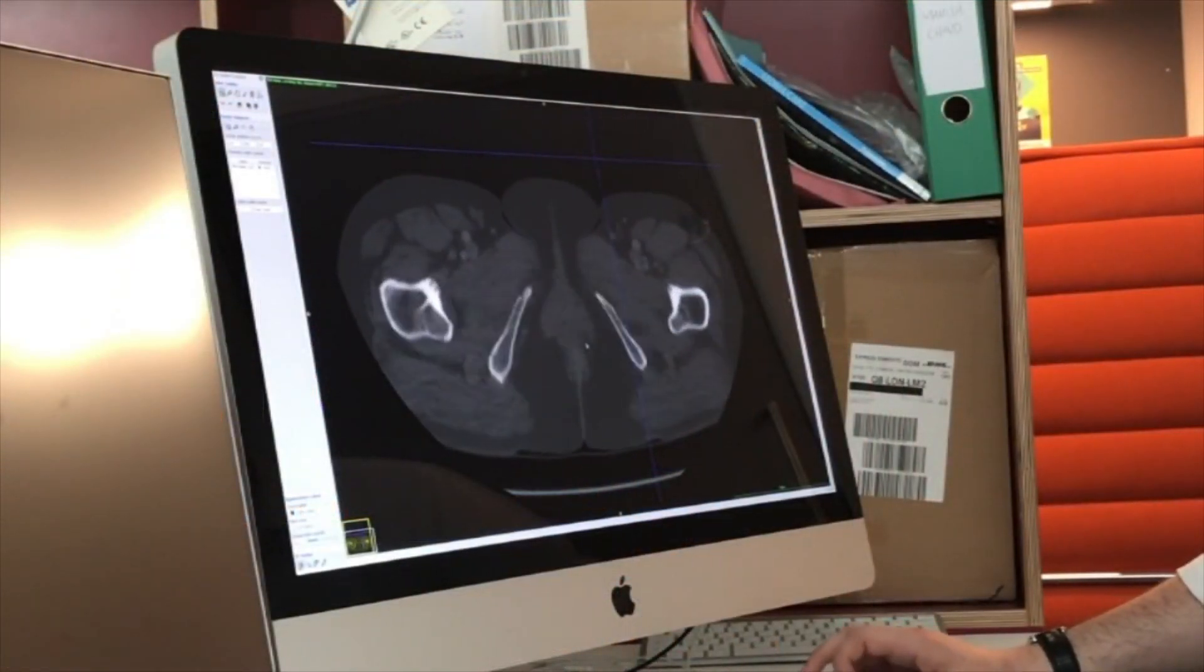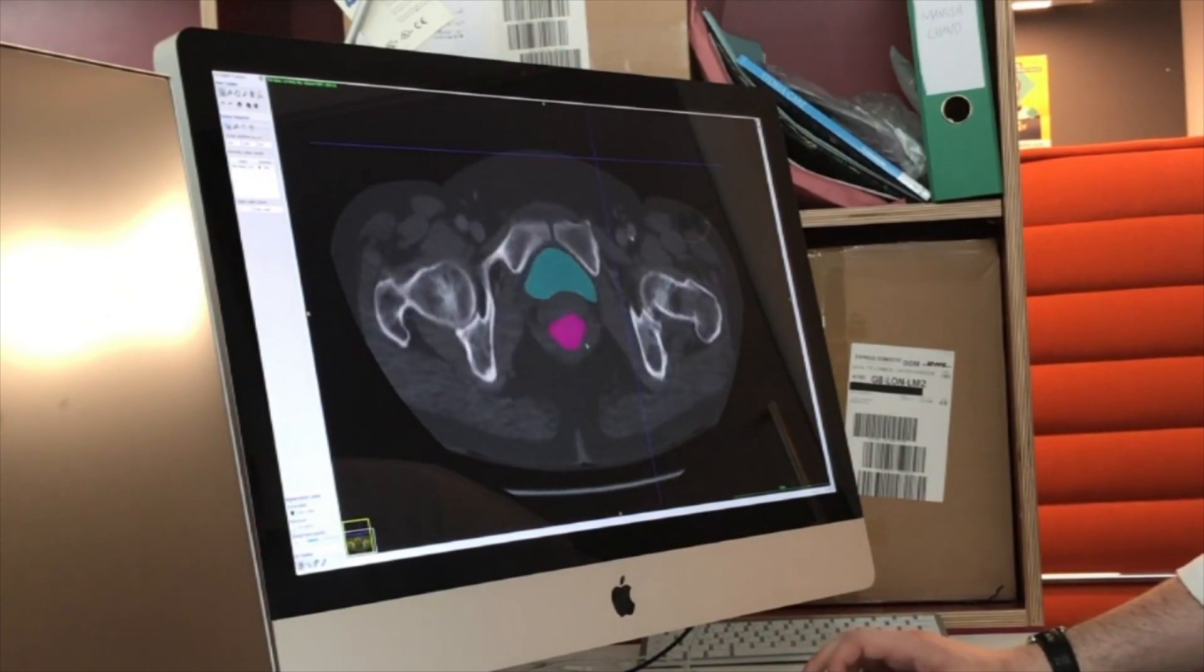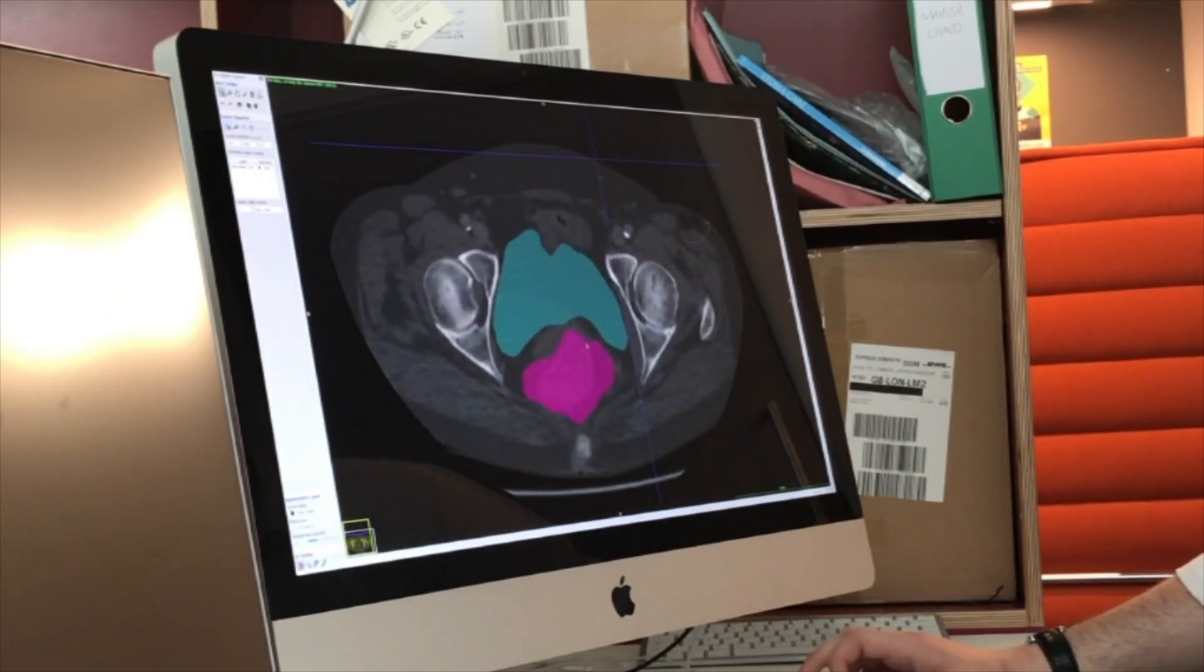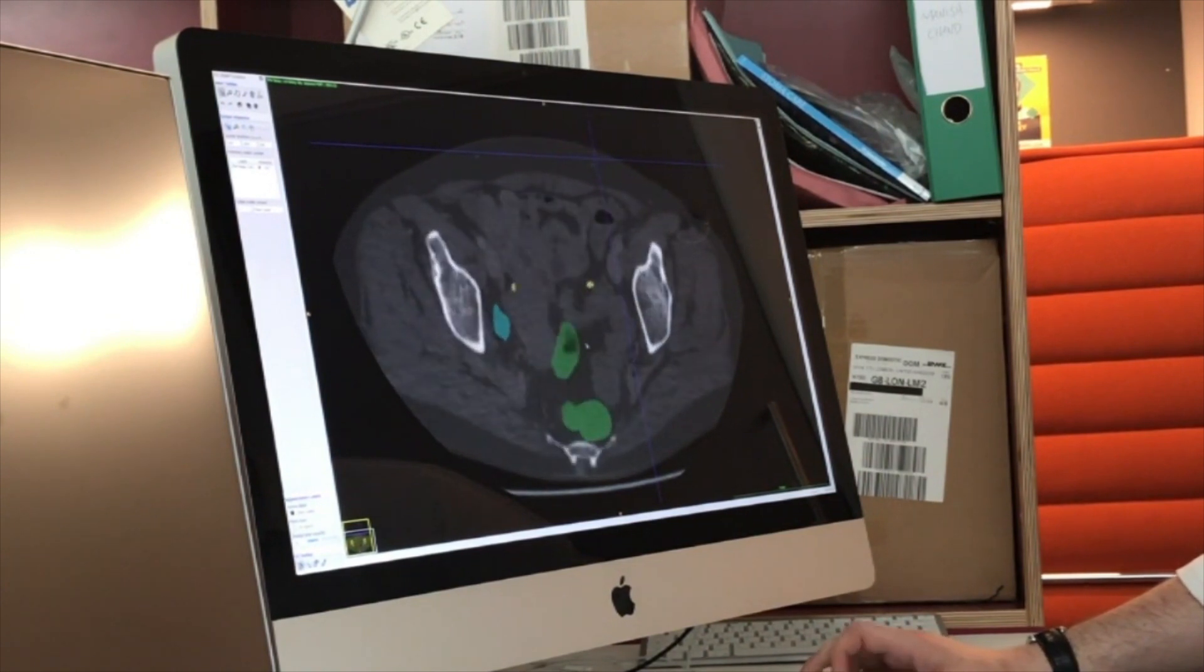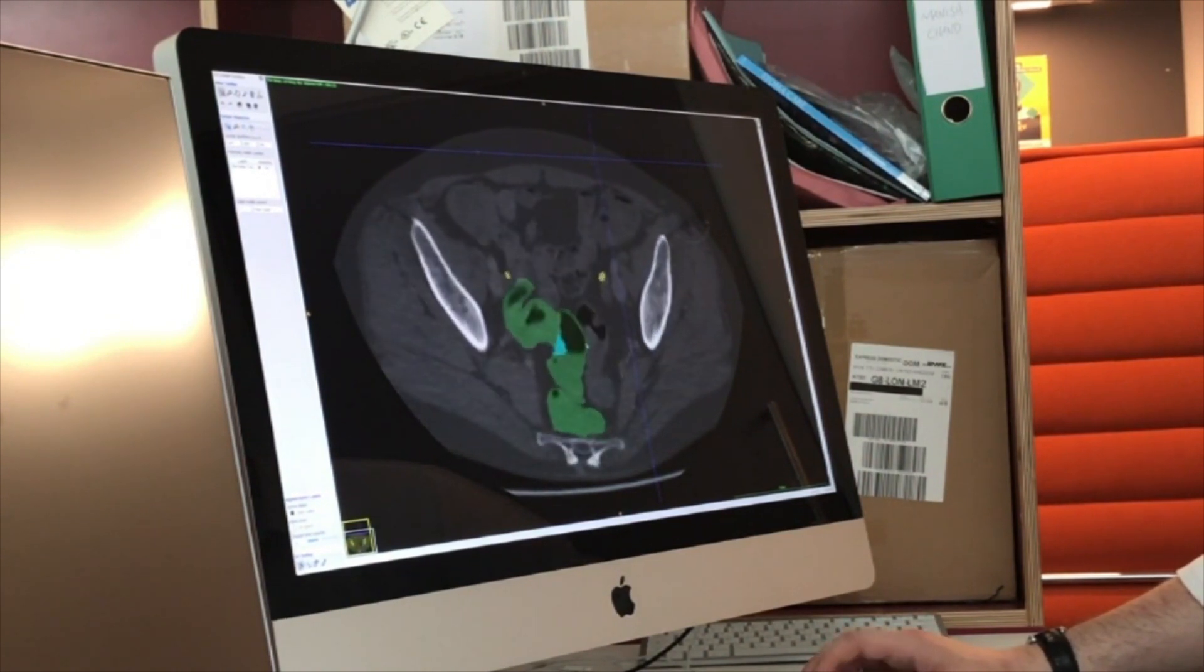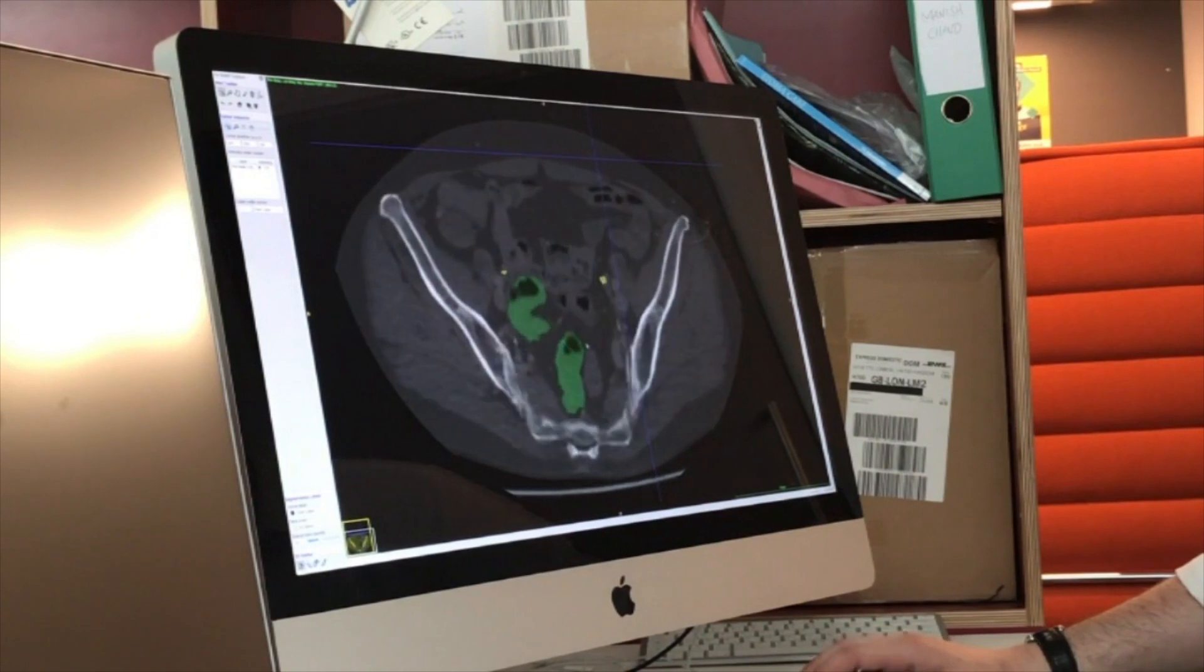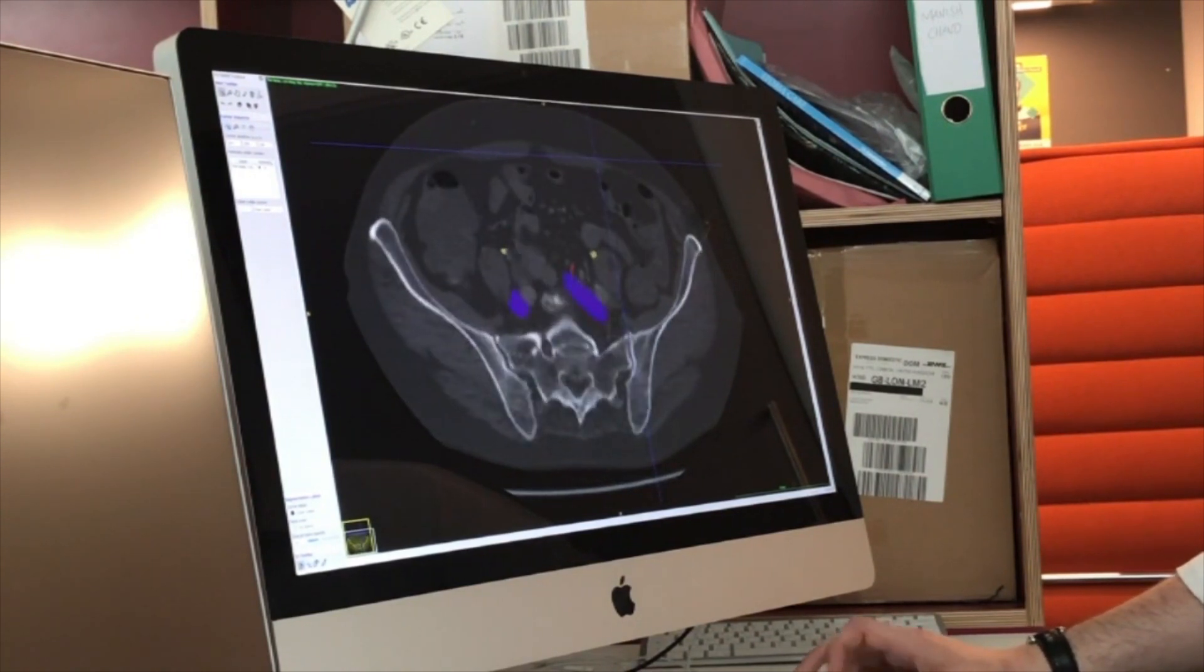Here we can see the original CT scan of the patient with each of the selected structures now highlighted in a different colour throughout the entire scan. These structures are then combined to form the initial three-dimensional model.